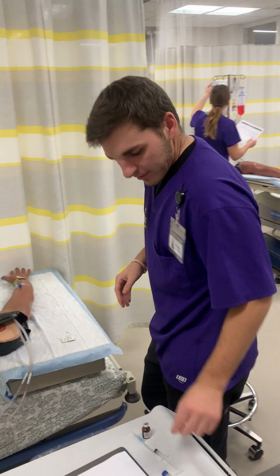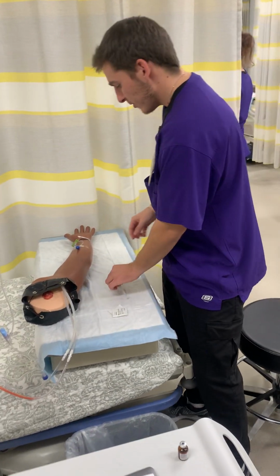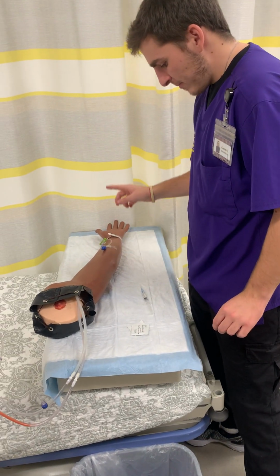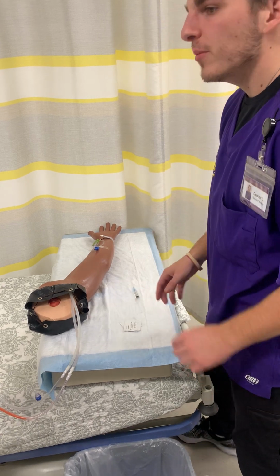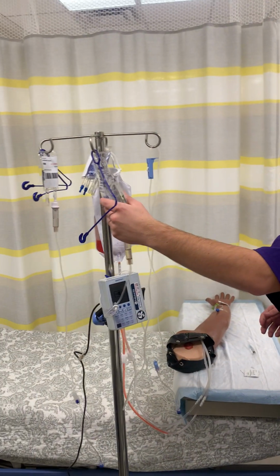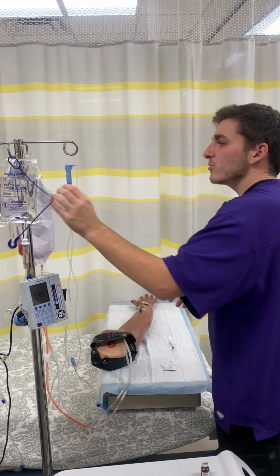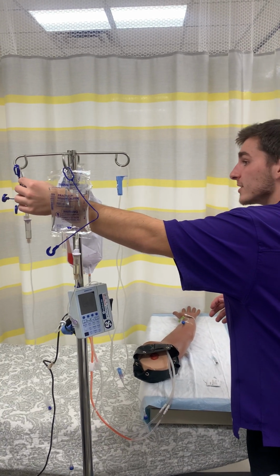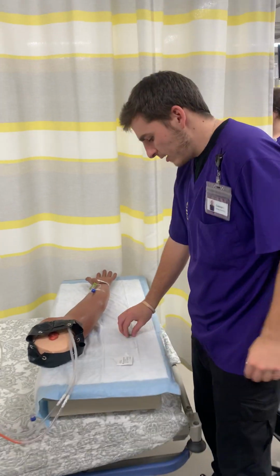So what I have here today, I have your dexamethasone, and I'm just going to put this right here. I'm going to flush it first, and then I'm going to give you your meds, and this is for your inflammation. And then we have your normal saline up here. This is for maintenance fluid as well. And lastly, we have your levofloxacin, and this is your antibiotic to help with your infection.